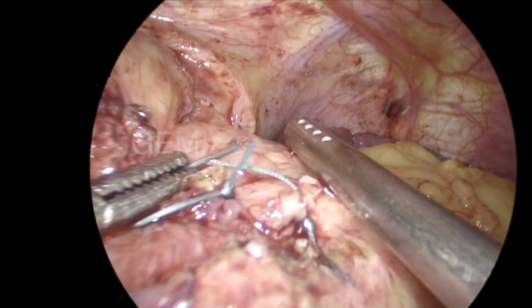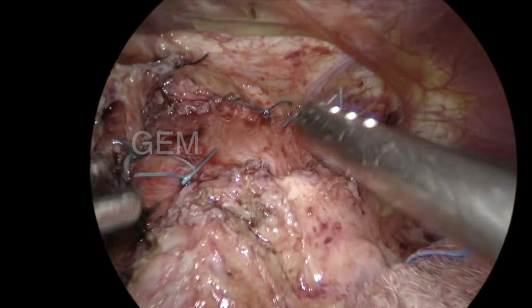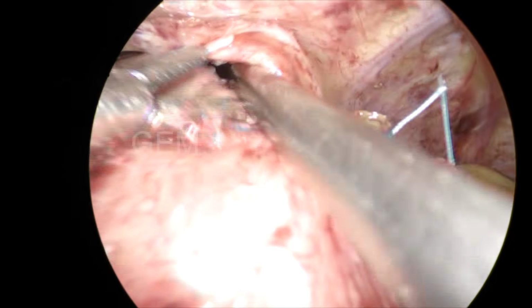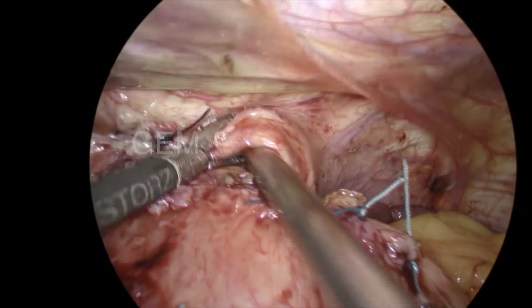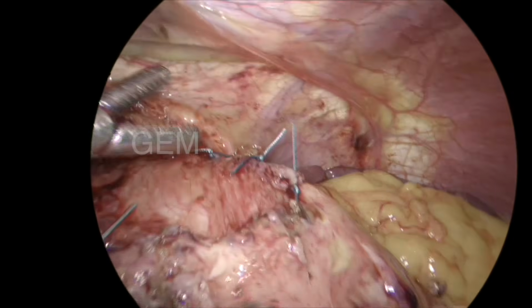I thought about whether any fixation of the wrap to the left crus is required, because it had already migrated, but there is not much gap. I am not doing that. I just check the wrap and the left crus. I am not doing it in this case. It should not produce any dysphagia.